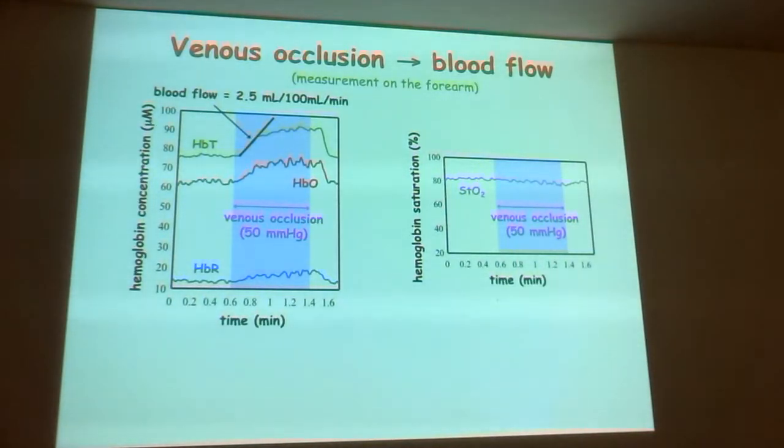And that is something we used to deal with a lot over 10 years ago with the brain activation measurements, because we were assuming there was no change in scattering. But then we did a lot of mathematical analysis, and we were basically able to show that the scattering change you'd get from that small change in hemoglobin was insignificant compared to the absorption change for the brain activation measurements. For these types of measurements, you're inducing much larger changes in the hemoglobin concentrations, and so that may no longer be true, and so you may have to worry about the scattering changes. In this specific data, because it was done with a frequency domain system, it already solved the problem because it separated the scattering changes from the absorption changes.